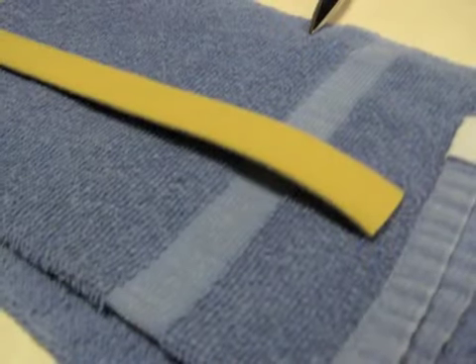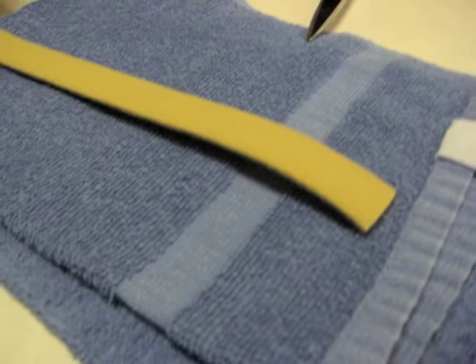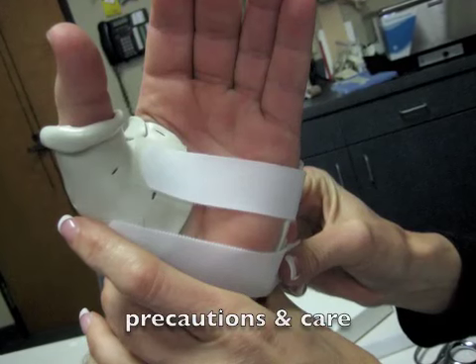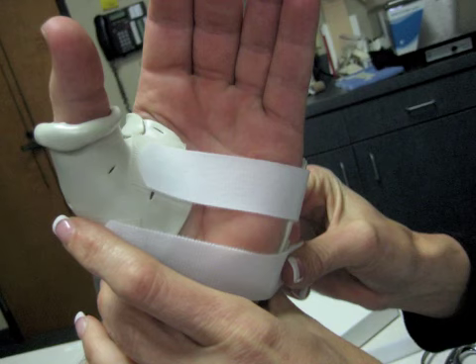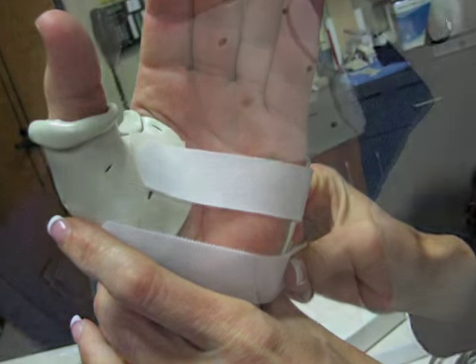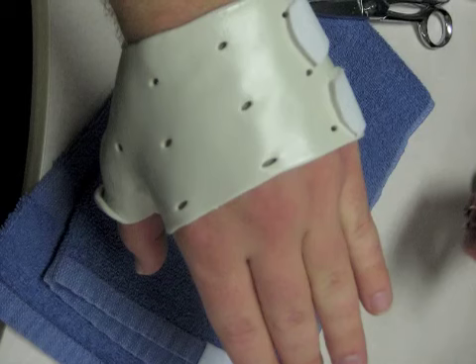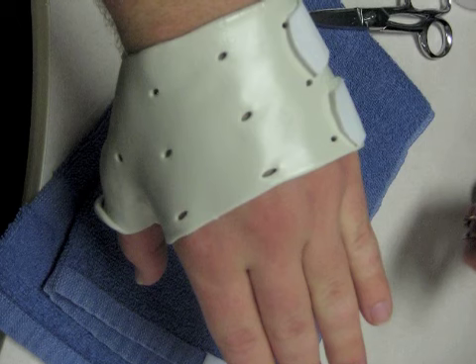If the splint is to be worn at night or is preferred by the client, a softer strap with more cushion can be provided. Once the splint is finished, provide education about precautions and care for the splint. Instruct your client to keep the splint away from open flames and to not leave it in a hot car because it may lose its shape. Also, instruct the client not to make any changes to the splint themselves — if changes are needed, they should contact their therapist.